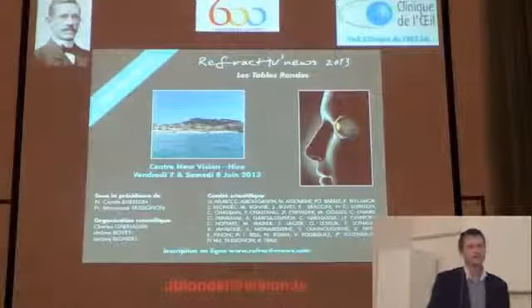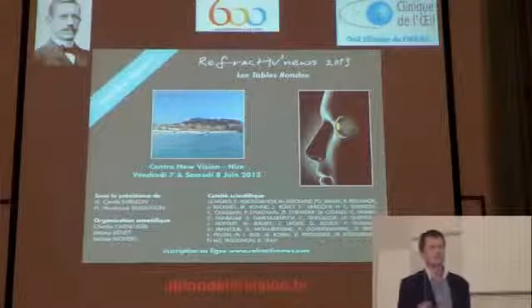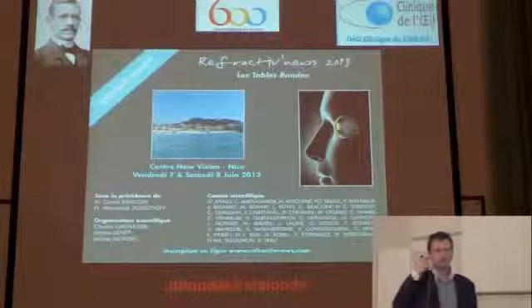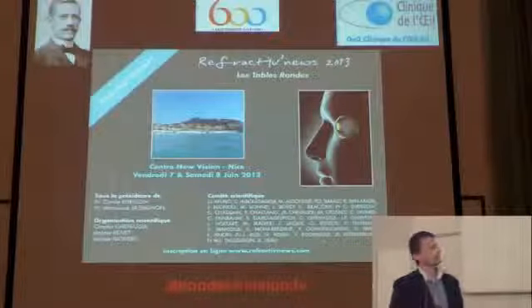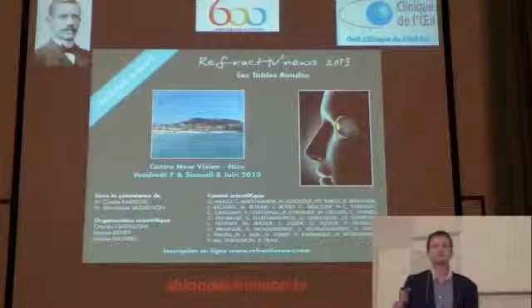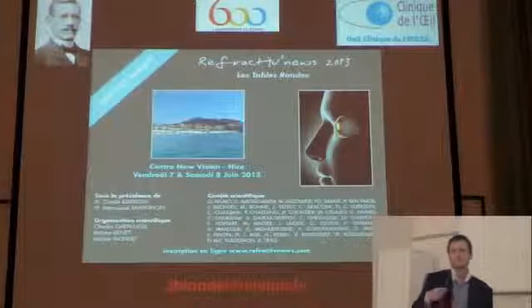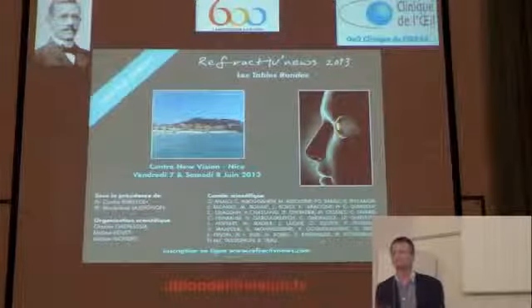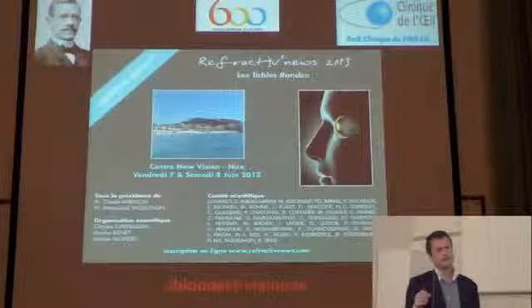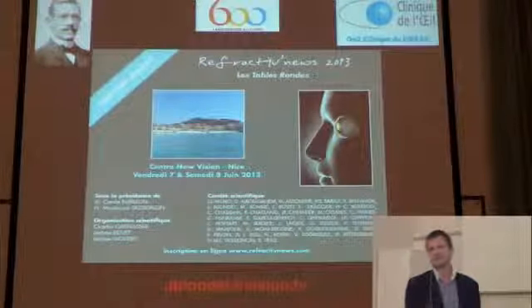Okay. So for these 3 inlays, I don't... The Kamra, I think it's very difficult to have a good centration, and maybe the black. I'm not sure it's a very good idea. FlexiView is difficult because you need maybe 2 or 3 different FlexiViews in your life. So I think Raindrop is a better idea. It's easier to put, and the functioning, the reshaping of the cornea, is more effective. I think it's more effective because with LASIK we do the same, and we know.